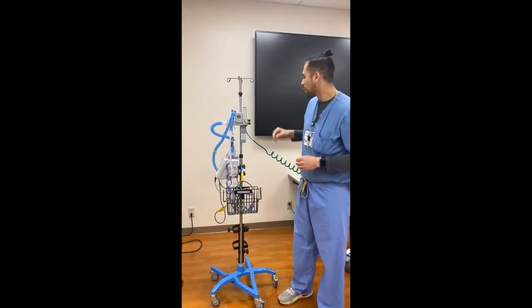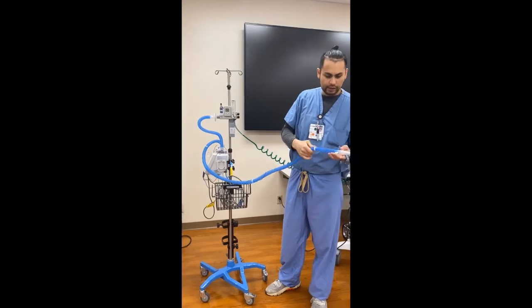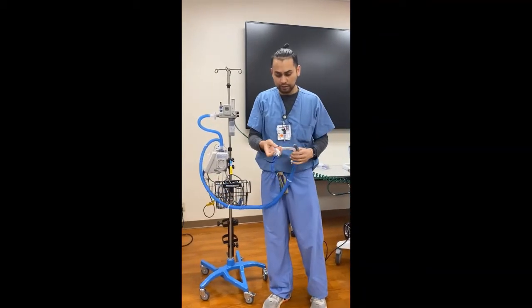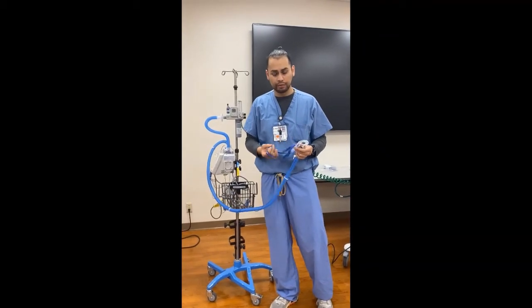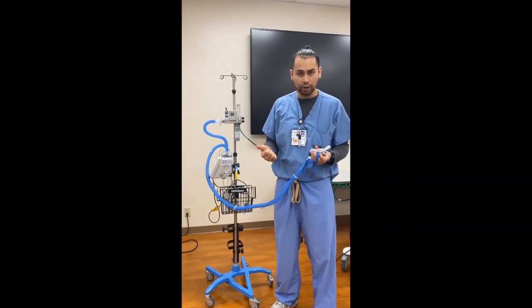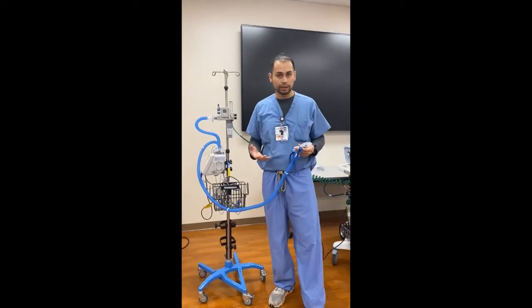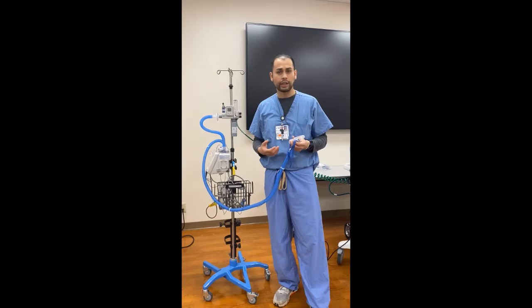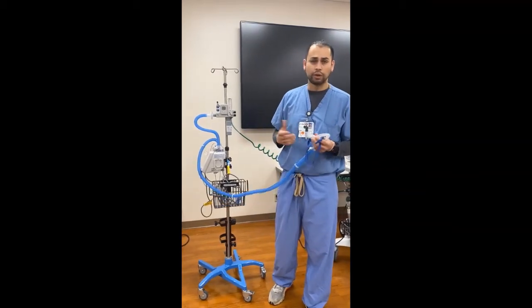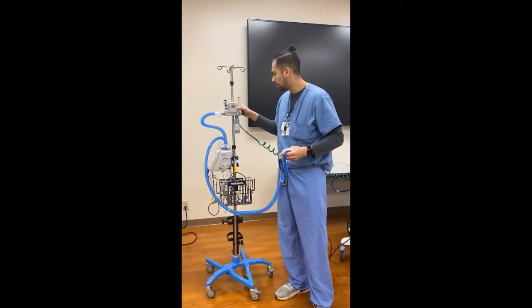We will be talking about the high flow nasal cannula, the BiPAP, and also the ventilator that we have. First off, we'll start off with the high flow nasal cannula. So it is a high flow device that can go up to 100% FiO2 to help with flow demands, the patient's needs for flow, and also oxygenation. Now, this device does not help with ventilation, but it does help with oxygenation in case the patient is hypoxemic or needing that extra boost of oxygen to help with their oxygen saturations.